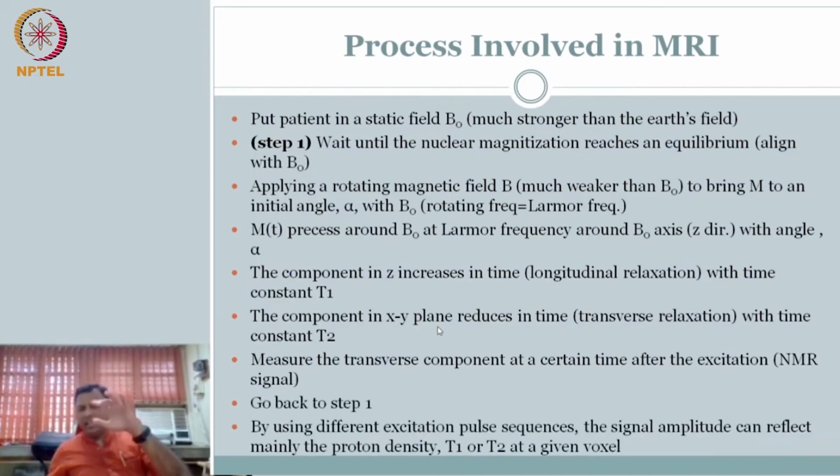Okay, we go into this again and again. And this is the whole crux of the story. So now you do this again and again, you get multiple measurements over time. That's the signal. So now we have come to understanding what the magnetization vector and signal are, and we have come to the level of understanding that we could manipulate this M so that you could get a longitudinal signal. I mean, you have the magnetization vector in the XY direction or in the Z direction. That much we have understood.